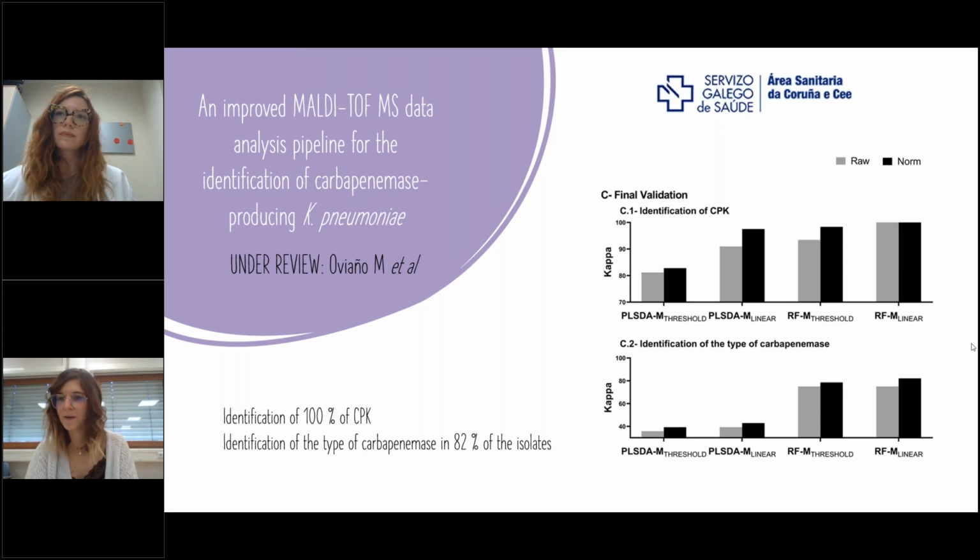We have a second question from Jack. Did your team evaluate the Bruker kits for carbapenemase or the cephalosporinase? Or do you have any feedback on their sensitivities?